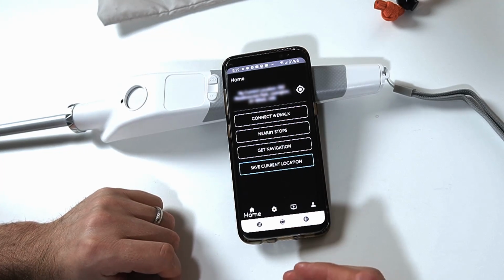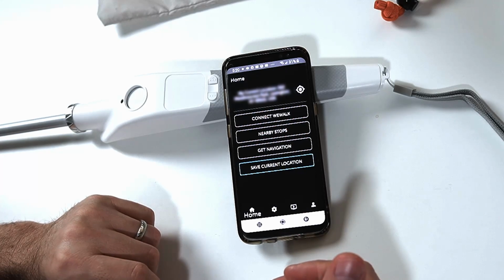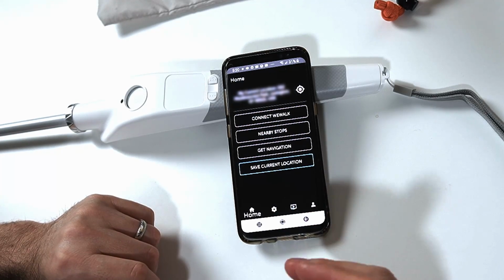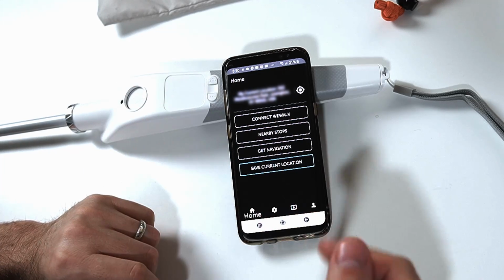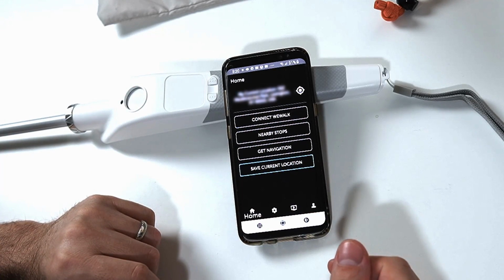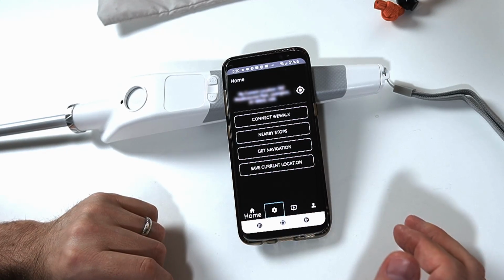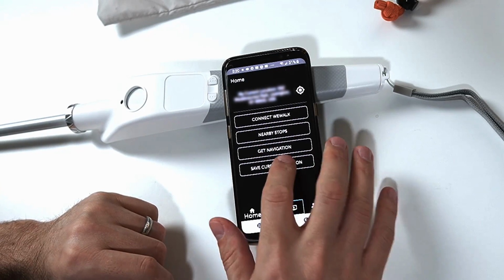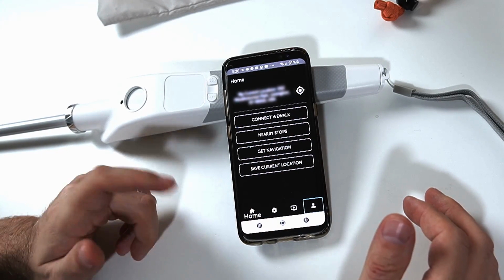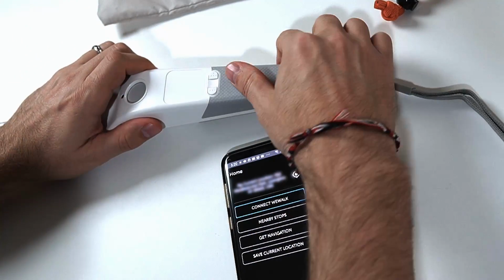So that's really nice. If you have a favorite coffee shop, you can save that as a location, and then later on you can bring up that location and navigate to it. And it does turn-by-turn navigation using Google Maps. Preferences, that's the settings. You've got a tutorial. And your profile. So let's turn on the WeWalk and get it connected.